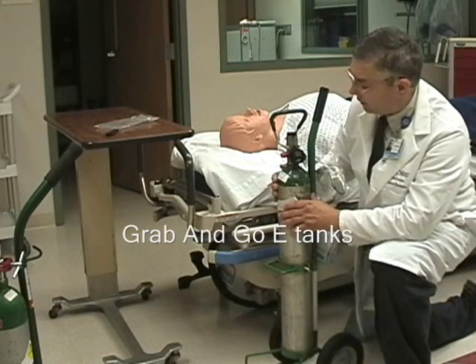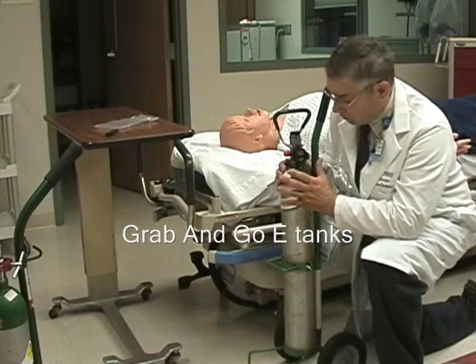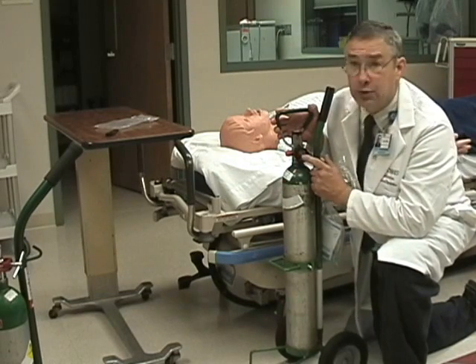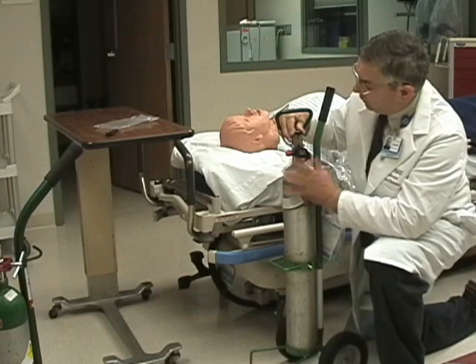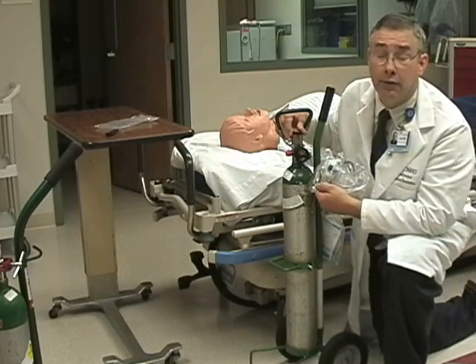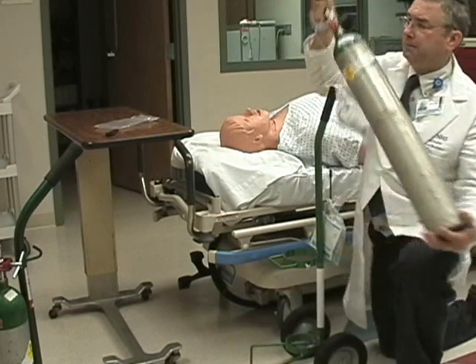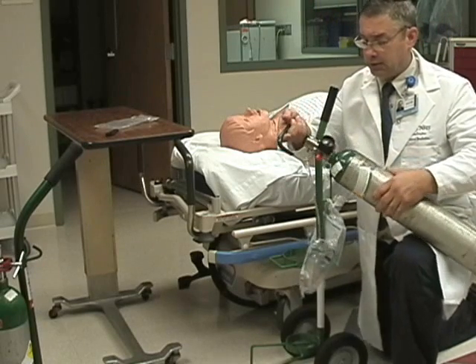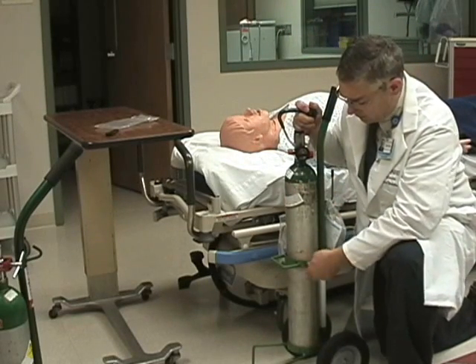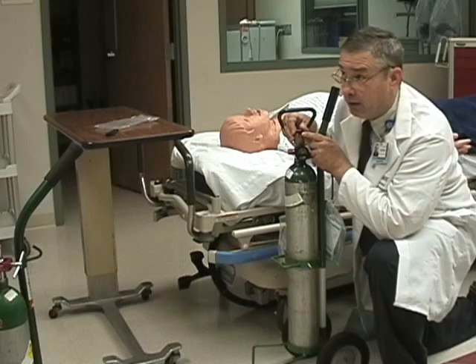The other style of E-cylinder is one that is completely contained — the tank and the regulator together. This regulator cannot be removed and it is always in the on position, so all you need to do is turn the flow on and you have your oxygen. It comes with a safety handle attached and should also be kept within the cart for maximum protection. When not in use, always make sure that the flow is in the off position.